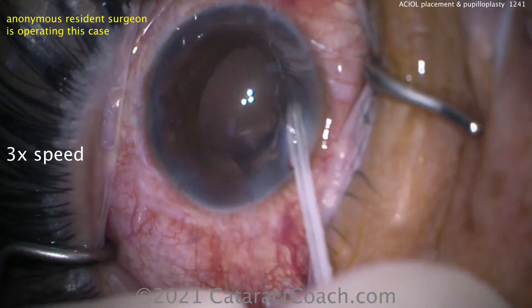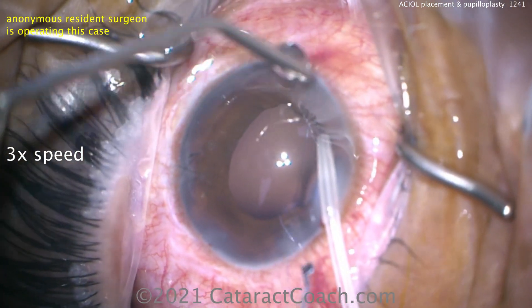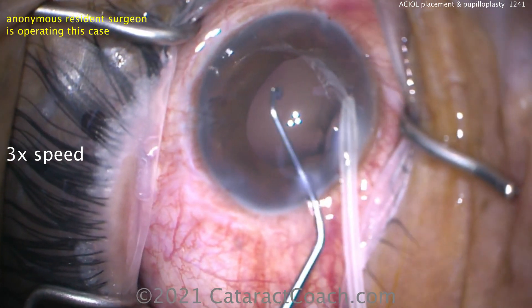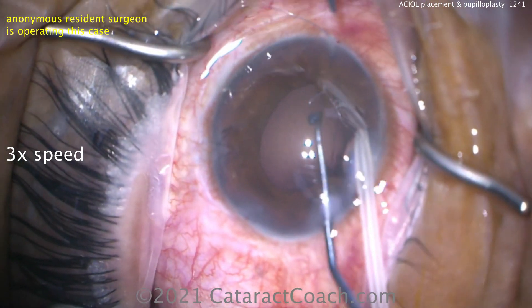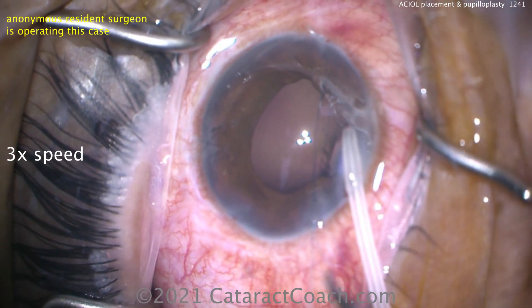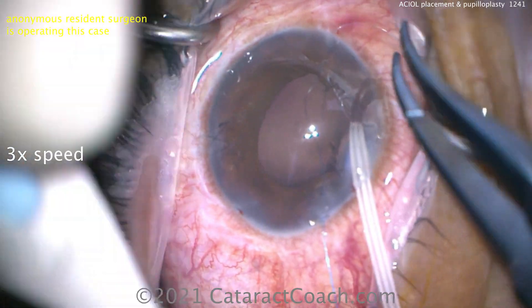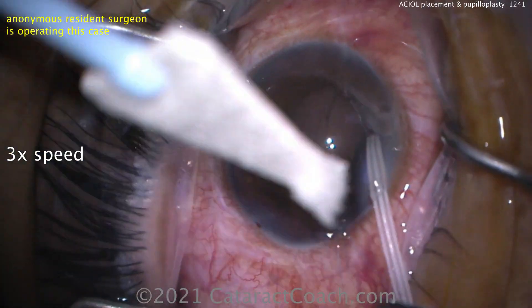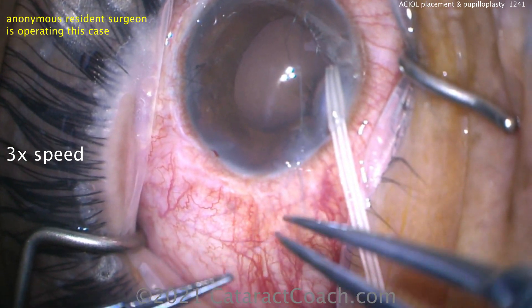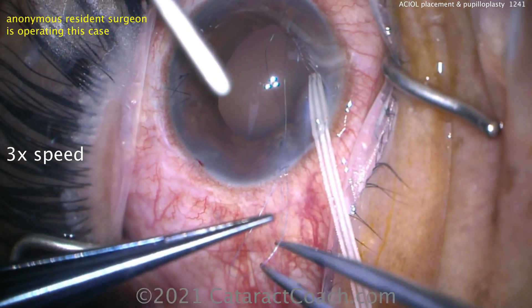Keep in mind: what's your ideal pupil size for this patient? This pupil is not going to dilate much. You don't want to make too small a pupil that's going to preclude you from having a view of the retina. Remember — this patient had retina trauma, intraocular foreign body stuck in the retina that had to be removed and repaired. So we want to be able to examine the retina. The minimum you're looking at is about a 4-millimeter pupil. Don't aim for 3mm or smaller. 3.5mm maybe, but 4 is your sweet spot.